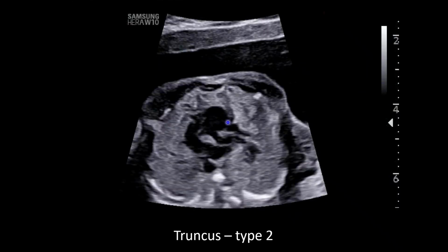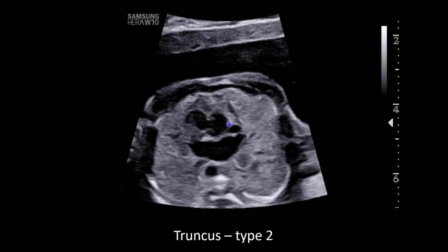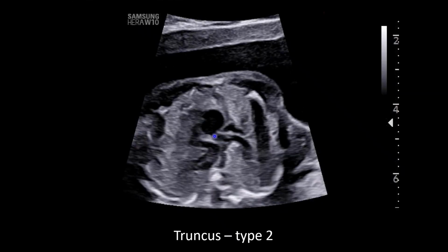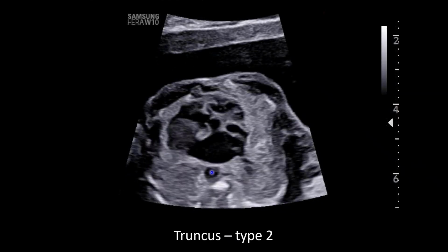And in this straight axial view here, sort of a 3-vessel view, where you're seeing SVC, here's the truncal root, pulmonary artery branches, they come off the same area, but they actually appear to cross a little bit in this view. Here's the descending aorta.